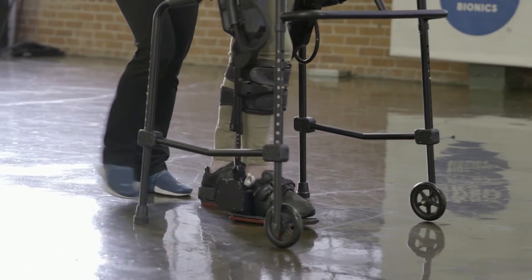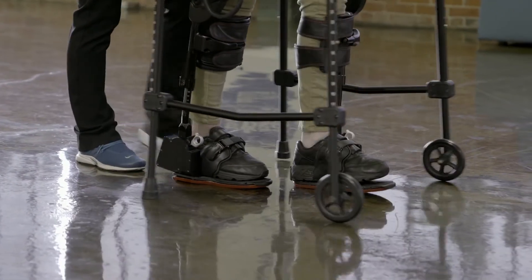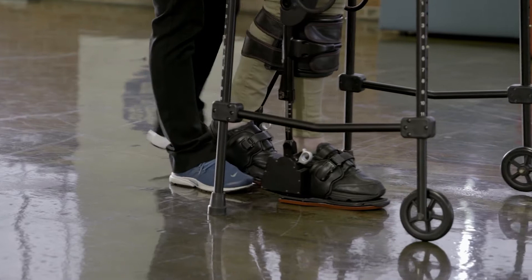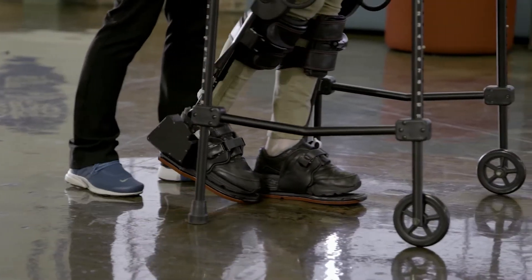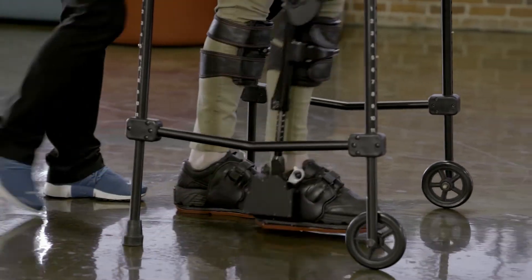XONR is approved to be used with individuals who have had a spinal cord injury, acquired brain injury, or stroke. The best candidates for using the dynamic nature of XONR have some lower extremity strength and gait training goals and potential.